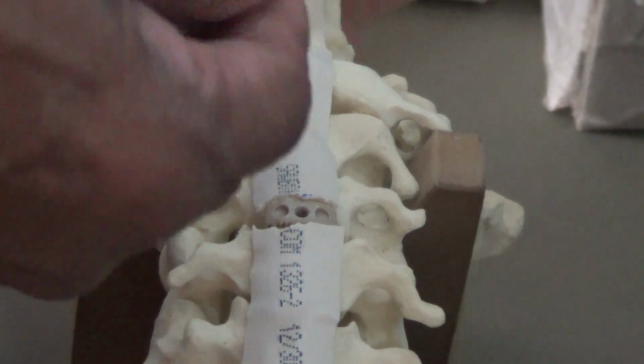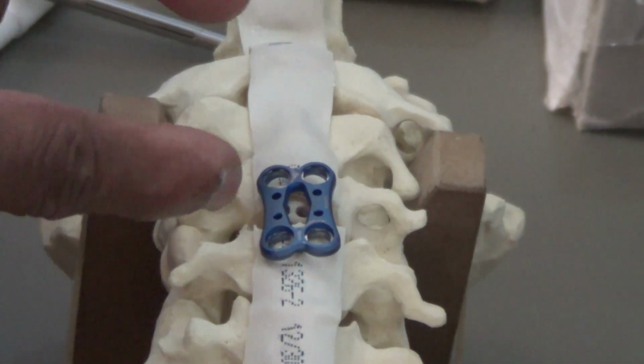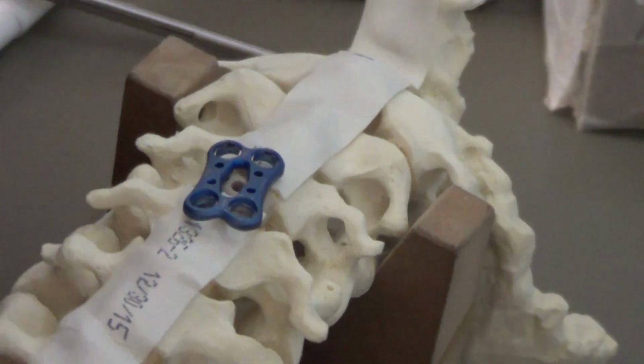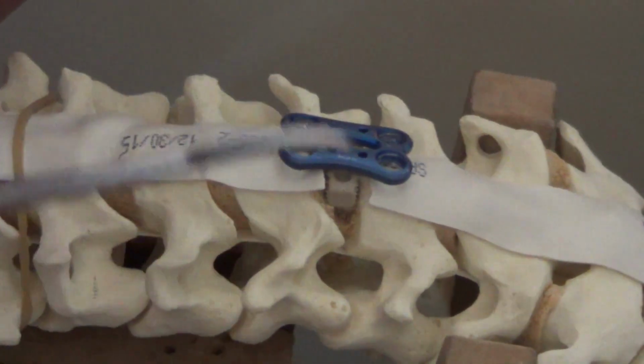So this is, you see, this is a plate. You put a plate in such a way that it spans the disc, and then you must be careful that your size of the plate is adequate. It's not too long, not too short, and then it's ideal that your plate doesn't go to about 5 millimeters towards the adjacent disc. Now, so this is how you put this plate. So select the plate. Usually the instrument vendors will bring different sizes of plate.